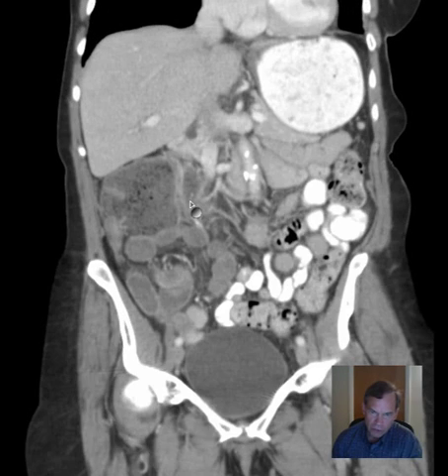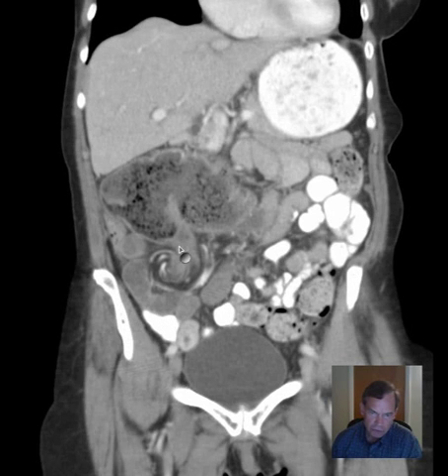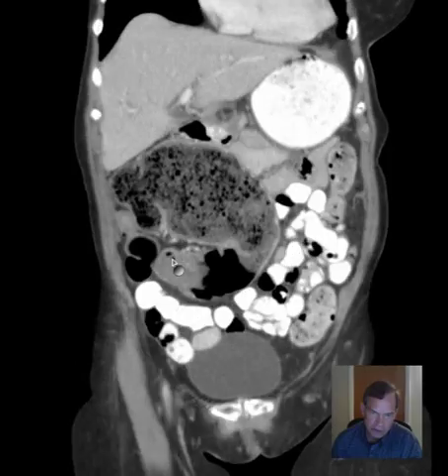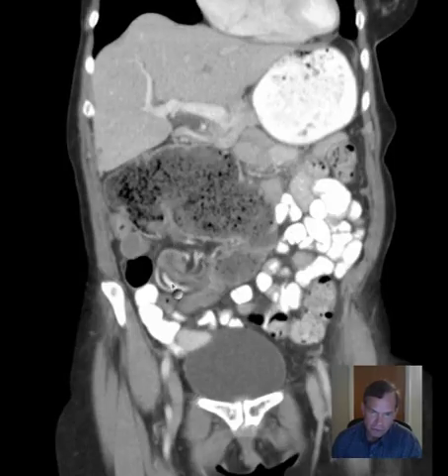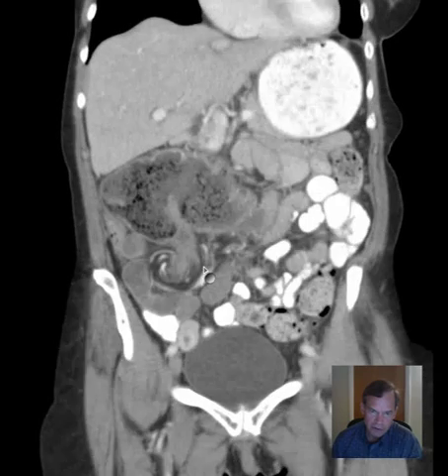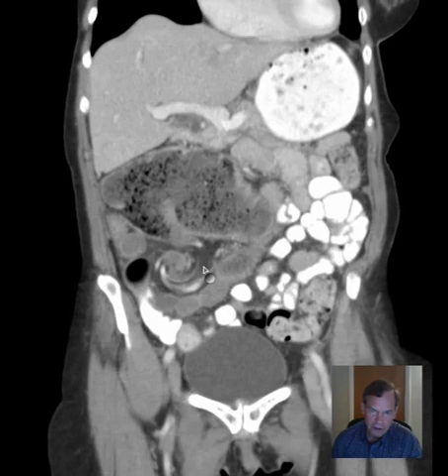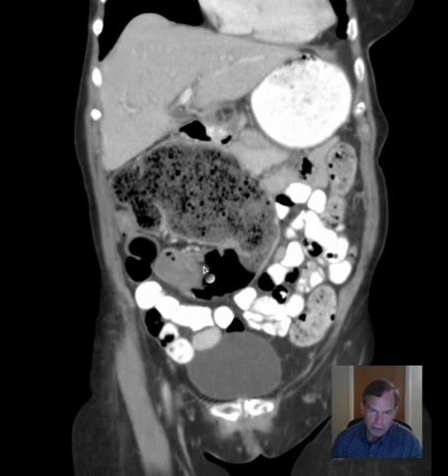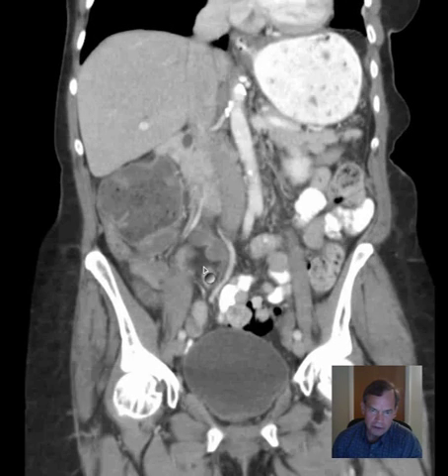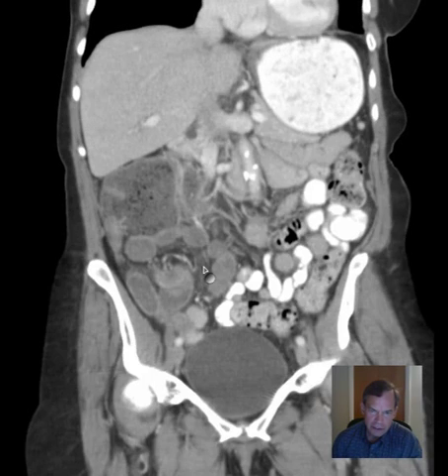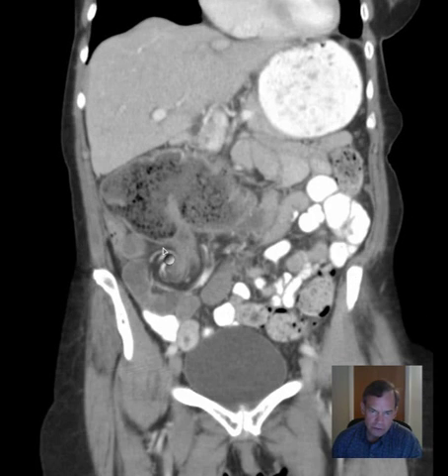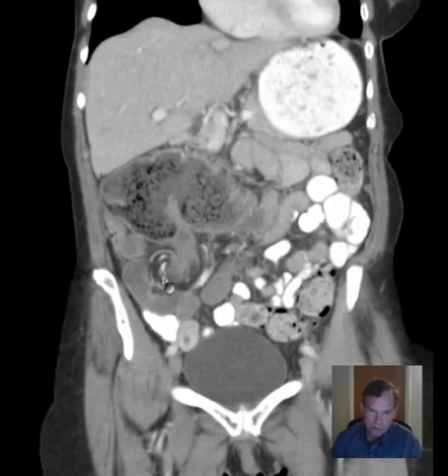And how would that happen? Well, if you look here, this is a very dramatic finding. Focus your eyes right on this area right here. And you see a twirling — and then we go back one way, and you see a twirling. You go back another way, and you see this kind of a whirlpool appearance.